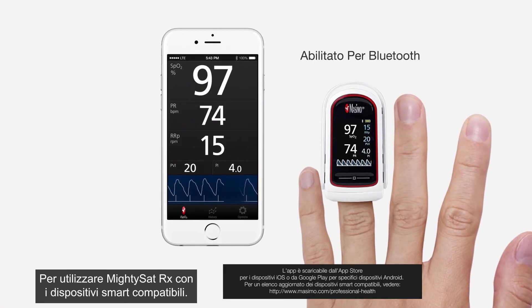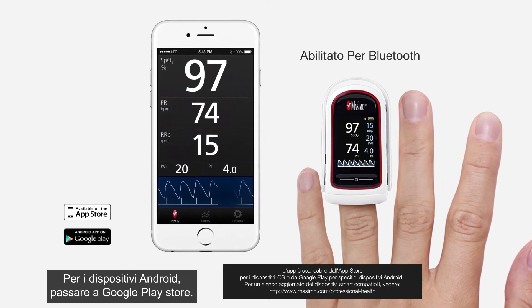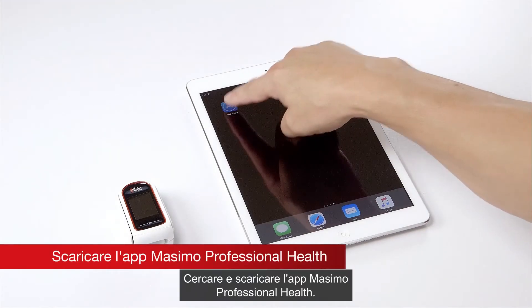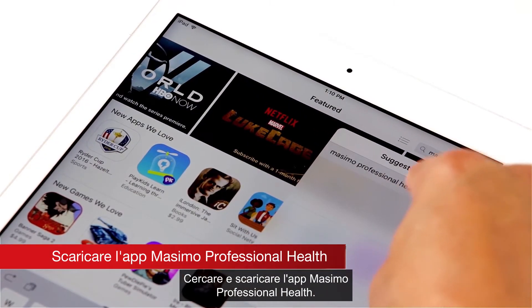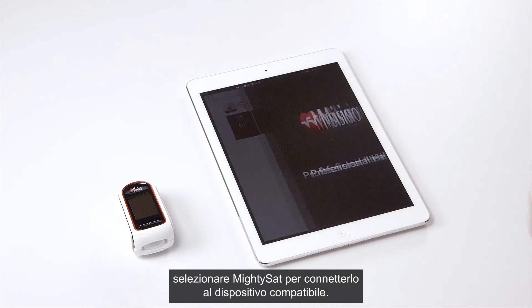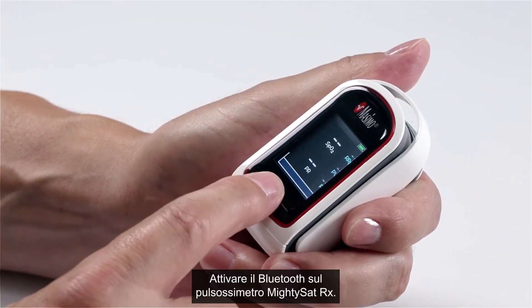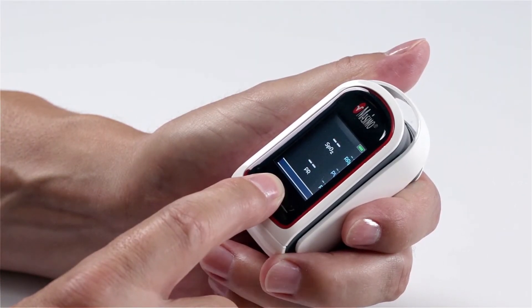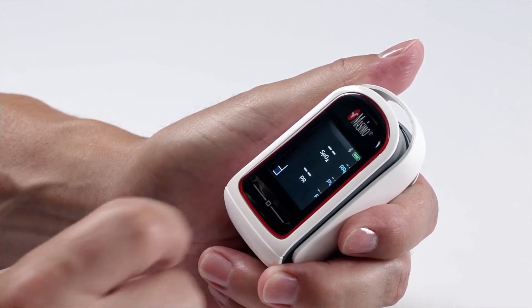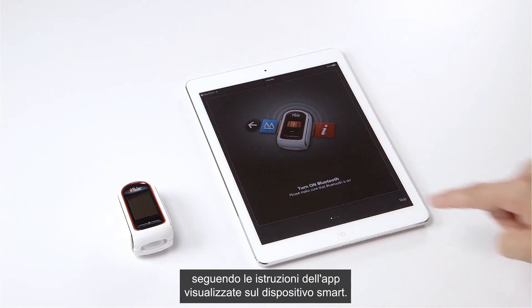To use the MightySat RX with your compatible smart device, go to the Google Play Store for Android devices or the App Store for Apple devices. Search and download the Masimo Professional Health app. When the download is complete, launch the app and select MightySat to connect. Turn on Bluetooth on your MightySat RX pulse oximeter, then ensure Bluetooth is enabled on the smart device, following the app instructions as shown.